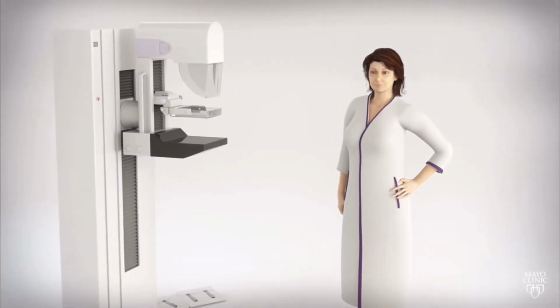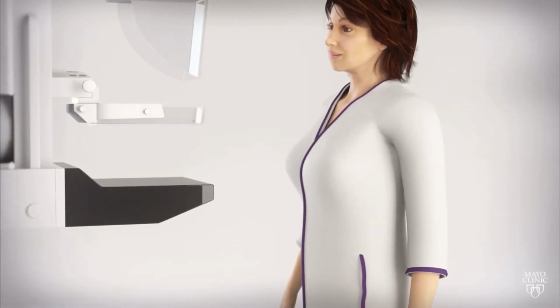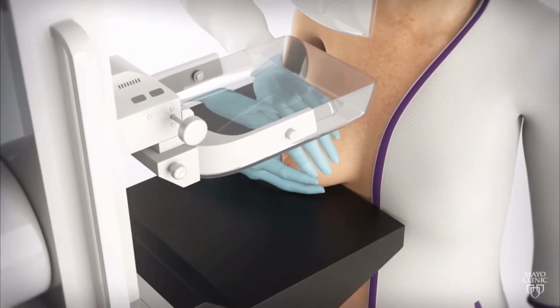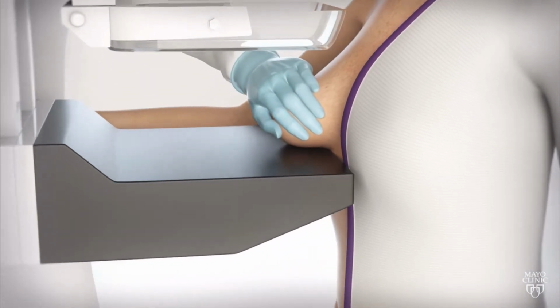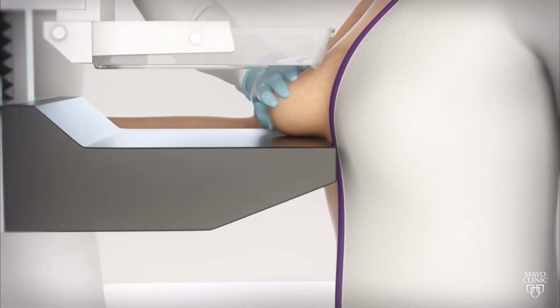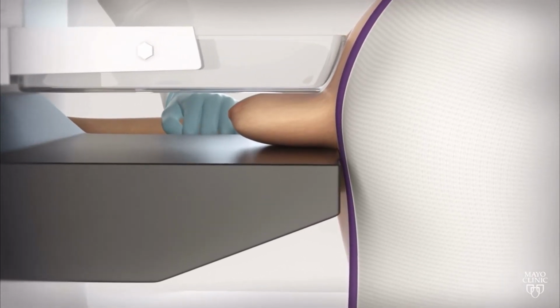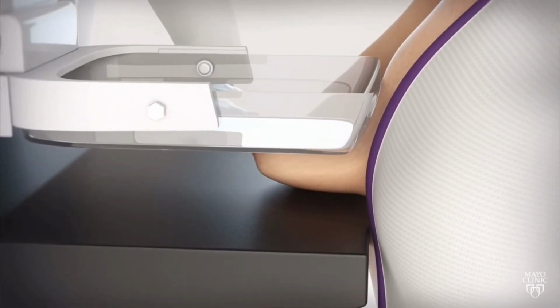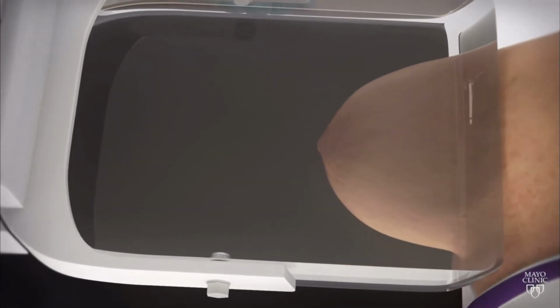A mammogram is a picture of your breast taken with a safe, low-dose X-ray machine. Your technologist will ask you to stand facing the mammography machine and then place one breast at a time on a flat surface. Another flat surface, called a compression paddle, will gently be lowered into place to compress your breast. Compression is necessary to spread out the breast tissue and to eliminate motion, which may blur the image. The compression may be uncomfortable, but shouldn't hurt. Compression usually lasts no more than 20 to 30 seconds. During this time, an X-ray beam comes from above and penetrates your breast tissue.